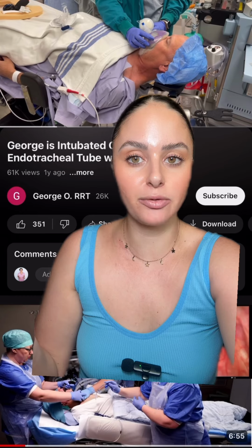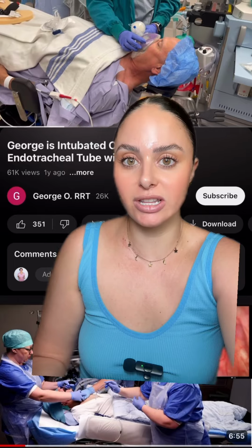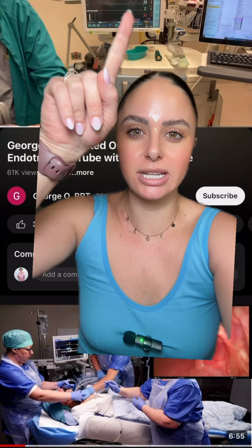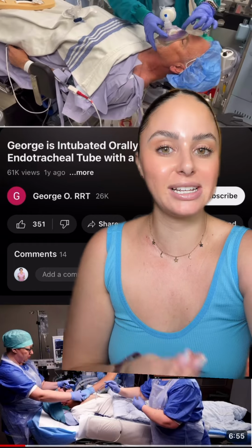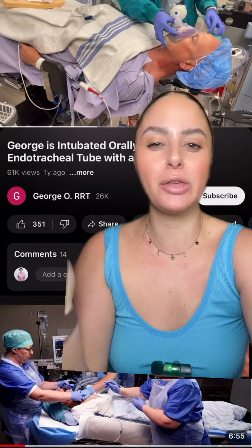The medications we give for intubation allow the patient to fall asleep very quickly. And as a nurse in the ICU, my job is to push medications and keep an eye on the patient's vital signs. It's a little difficult to see, but you will see the patient's respiratory rate here go to 0, and then their end tidal will also disappear as well. In the OR, your anesthesiologist is doing all of these steps, but in the ICU, typically the provider is intubating and then we are doing all the other little things.